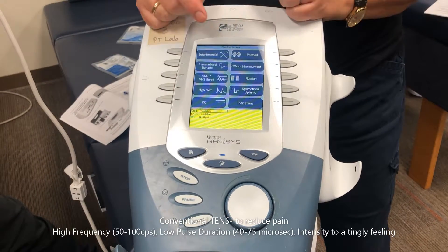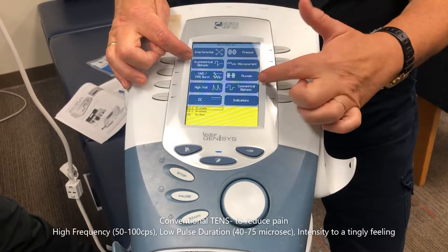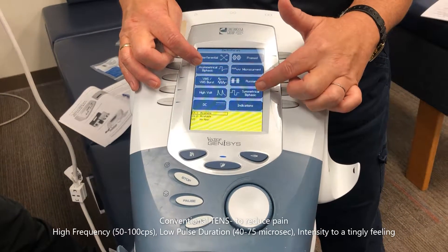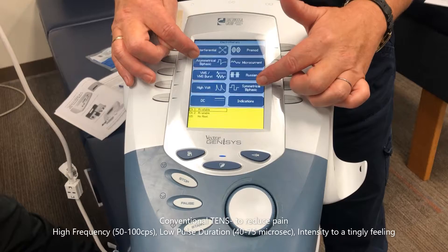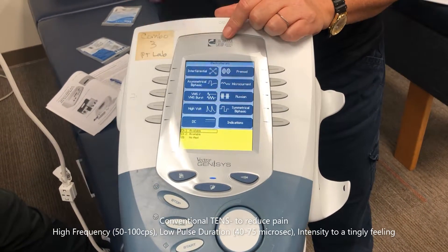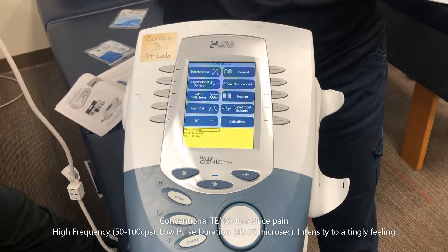The two remaining options are asymmetrical biphasic and symmetrical biphasic — and it's a bit of a funny setup. Both are TENS. Between the two, I compared asymmetrical and symmetrical.